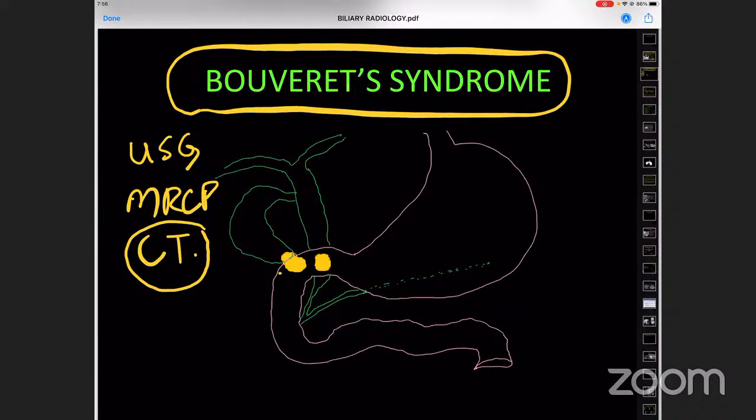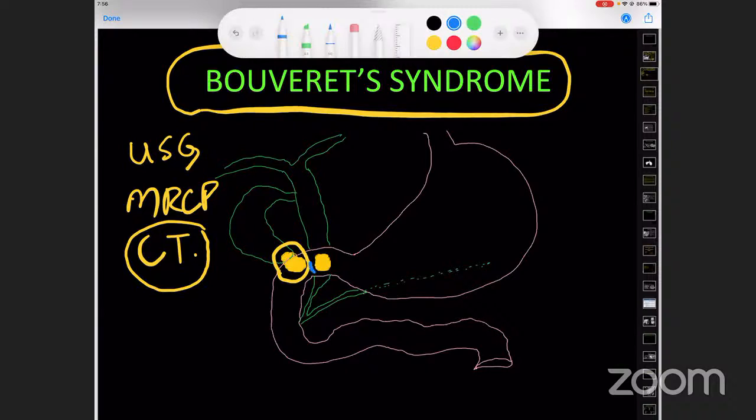I have personally seen people have a choledochoduodenal fistula from a stone. And I remember one patient who came to us with features of recurrent cholangitis and features of gastric outlet obstruction. We did a barium and we had a perfect MRCP demonstrated on that barium. I'll bring that X-ray when we do the next session of biliary tree radiology. I'll almost certainly bring that. Okay, that means that God did the choledochoduodenostomy for you guys. So what operation did you guys do?